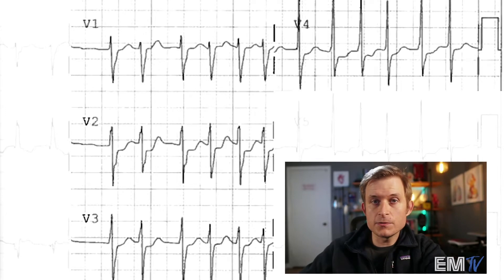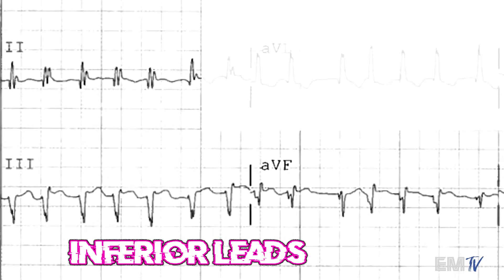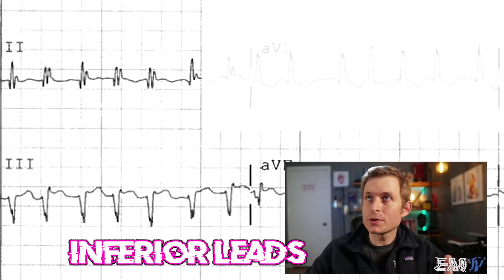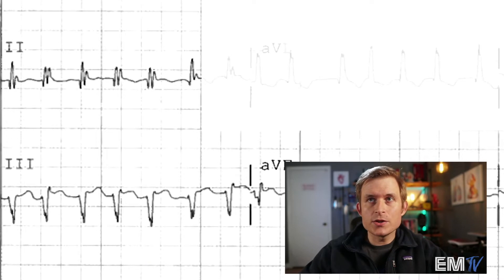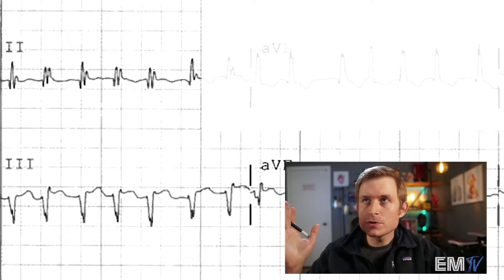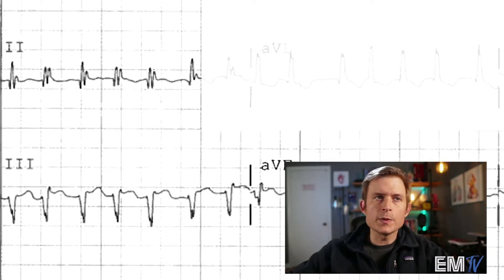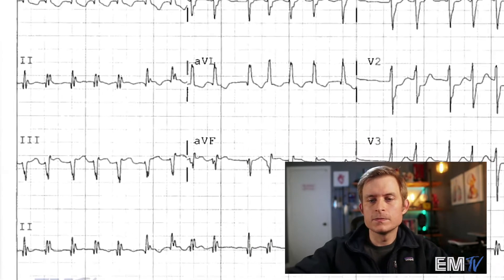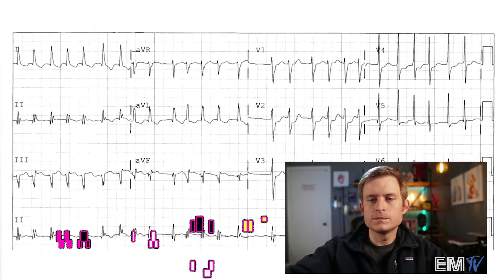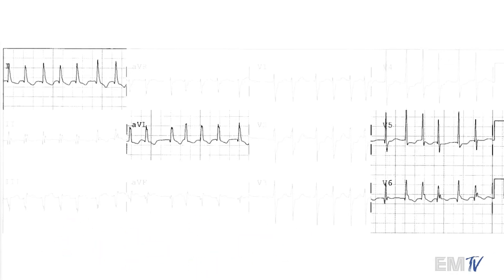Let's go ahead and look at the inferior leads. For the inferior leads, nothing generally acute here — again, just that widened QRS, the notch which may be indicative of a conduction delay, and that super fragmented or almost RSR prime type pattern in Lead 2, but really nothing to write home about. Our lateral leads are offering no additional information either, so let's take a look at the scenario and determine whether this patient is stable or unstable.